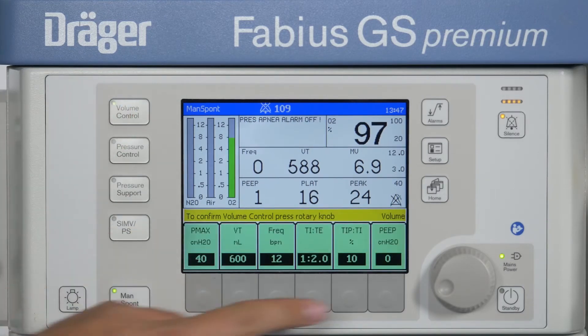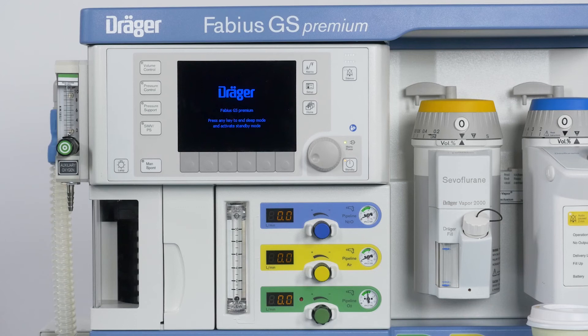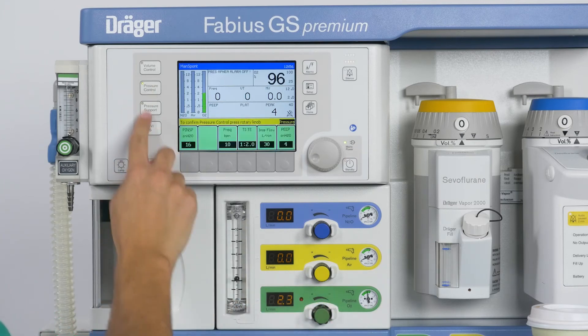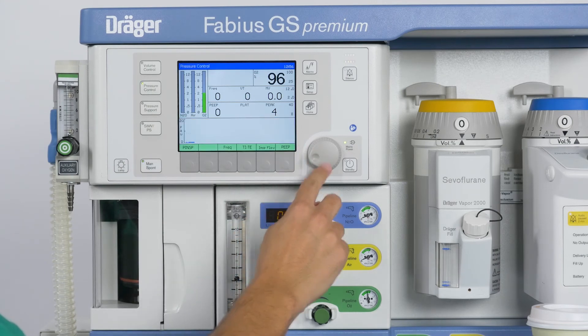Then you can select an automatic ventilation mode. If the device is already in standby or in sleep mode when you turn on a fresh gas flow, the Fabius GS Premium automatically wakes up and starts the Manspont ventilation mode. You can then manually ventilate the patient or directly start an automatic ventilation mode, for example, pressure-controlled ventilation.